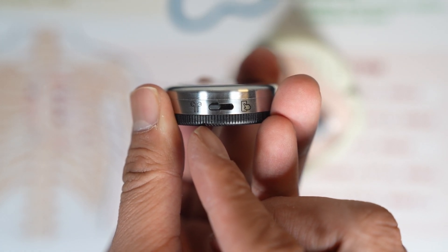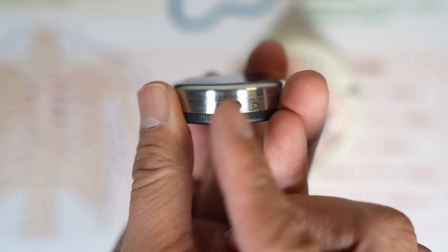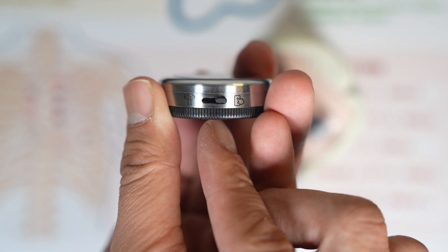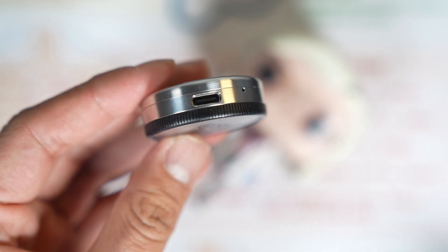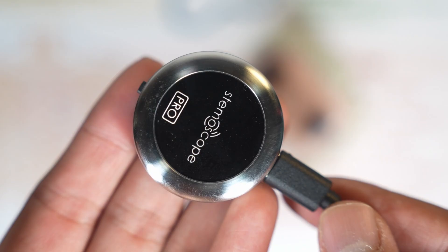You'll find a toggle for it here — left for earphones and right for Androids or iPhones. On the opposite side is the charging port. It uses USB-C, and the light lets you know when it's charging.